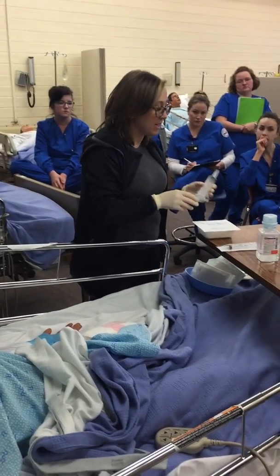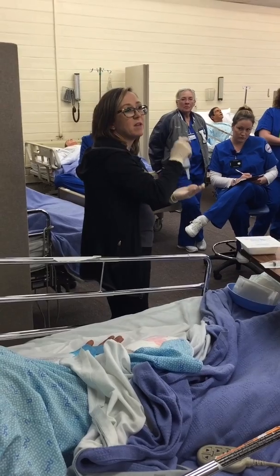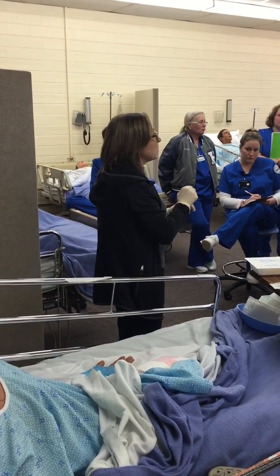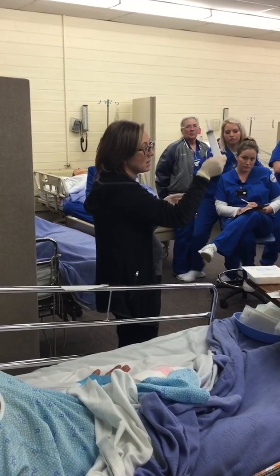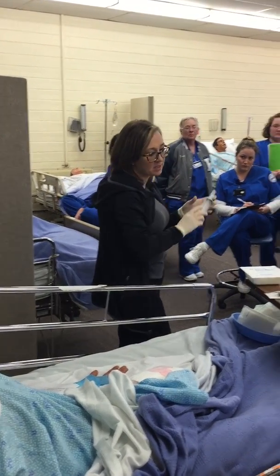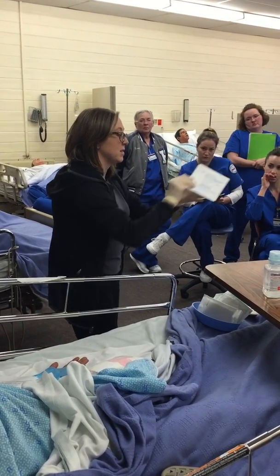So I have my thing, and this should actually be in a container. Do we have that? Does anybody have an irrigation container in your kit? Yeah, but one of you go get that, because I can't demonstrate this. Like I have to have the container because this is not going to be sterile. This has to stay sterile. That way I can show you. So I'm going to prep all my gauze and stuff.